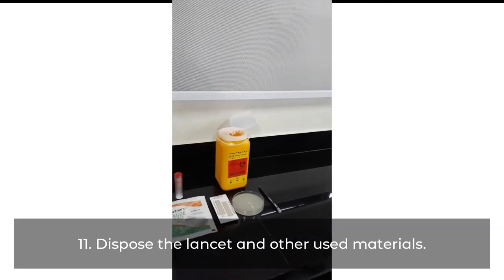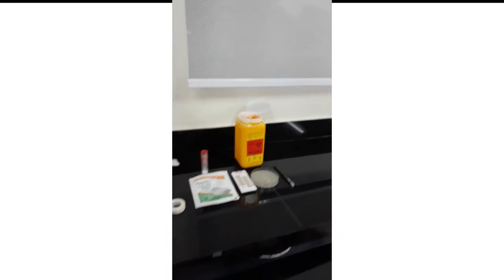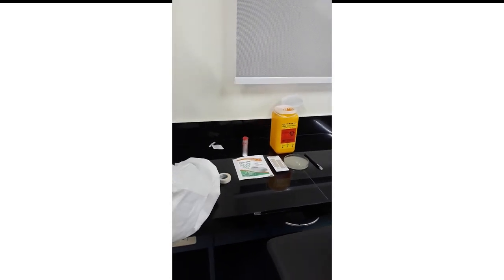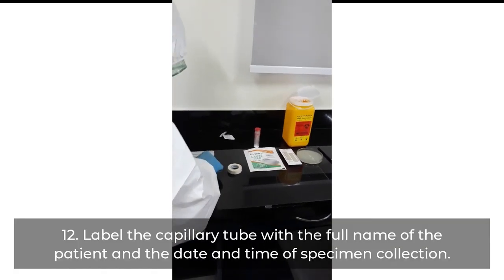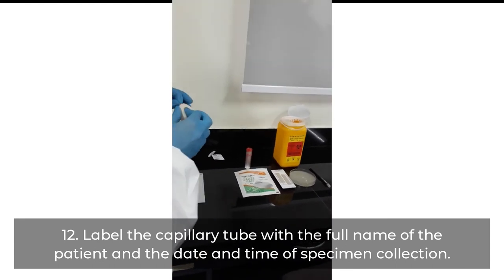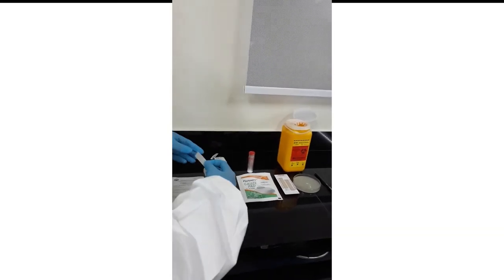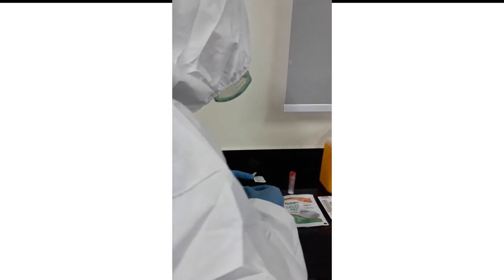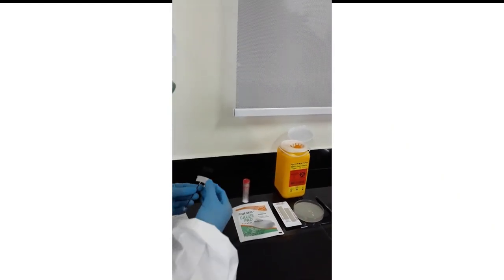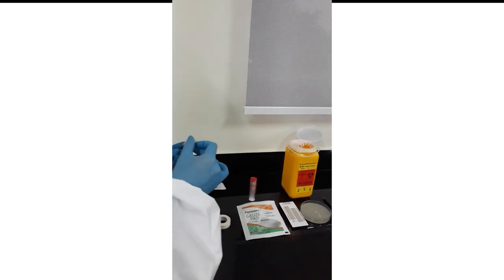Dispose of the lancet and other used materials. Label the capillary tube with the full name of the patient and the date and time of specimen collection. Capillary tubes must be labeled in the presence of the patient. Check the condition of the patient before leaving. The phlebotomist may also show the tubes to the patient to ensure accurate labeling of the samples.